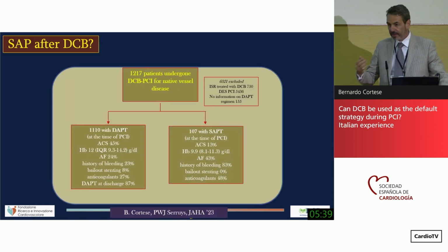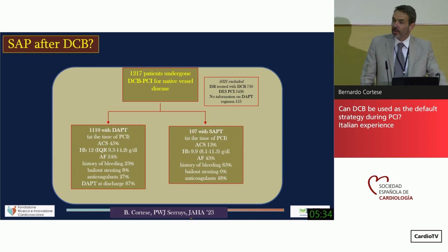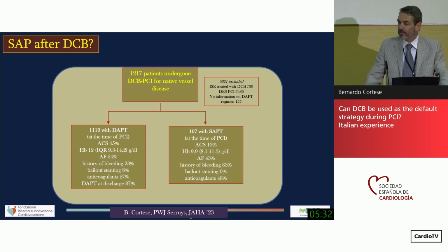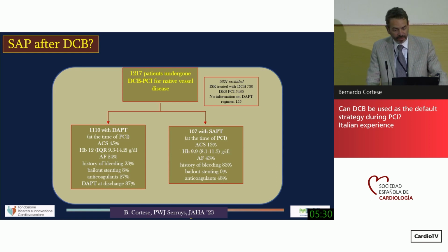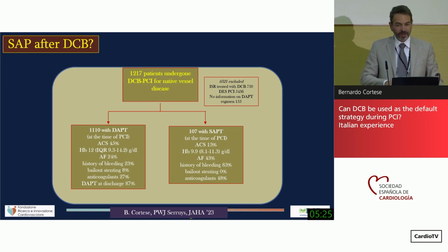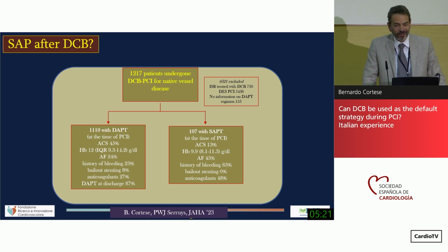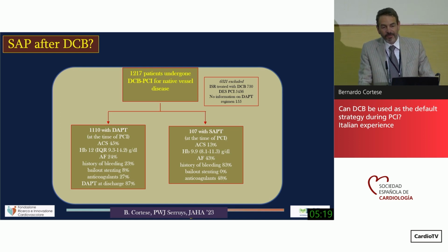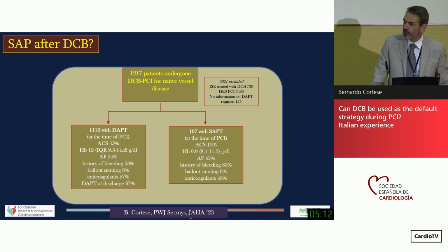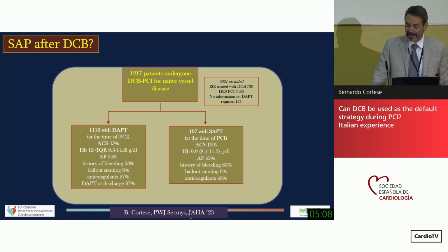Another topic, again, coming, high-bleeding risk patients are so many, either those with a bleeding and active bleeding, but also those at high risk. So this is why, in parallel, it was a fight that Thomas won, actually, because he published his paper 1 month earlier than us. But the main message is the same. In this study, we wanted to analyze the performance of 107 patients treated only with single antiplatelet therapy from day 0, okay, because they were at high bleeding risk.